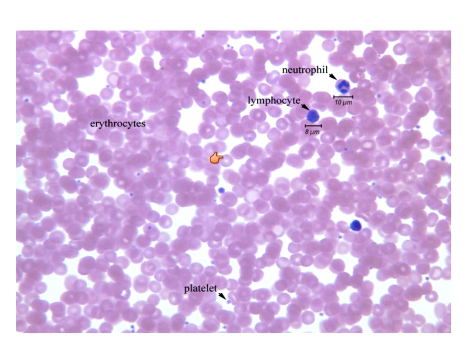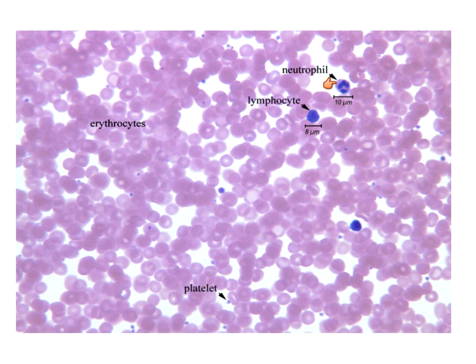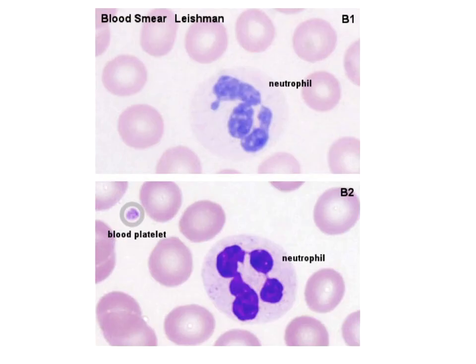Looking at a slightly different microscope picture, we still see all of our donut-shaped erythrocytes — the common name being red blood cell. Thrombocytes are the scientific name for platelets. We have a lymphocyte here. This magnification is probably at 10 times, so it's considered low power. But we do see this lymphocyte has very little cytoplasm, and its relative size is not that much bigger than an erythrocyte. Then we have our easily identifiable neutrophil because it has that multi-lobed nucleus with three lobes.